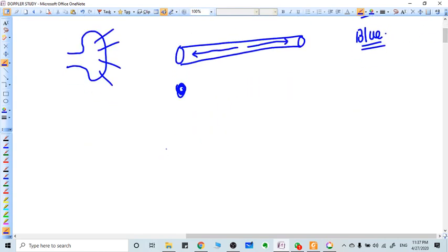Now we need to look at the waves, the graph, how the graph becomes. See, for example, when there is a systole, the flow is towards this probe. Imagine the flow is towards this probe, so it has some velocity. The color Doppler also measures the velocity of the flow.